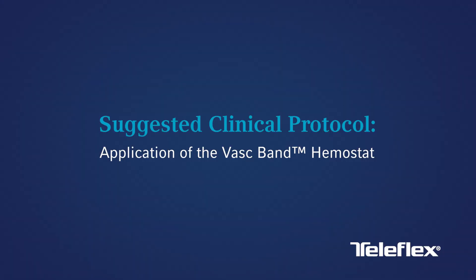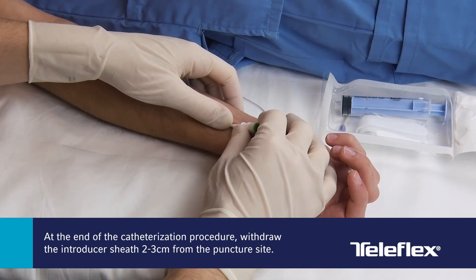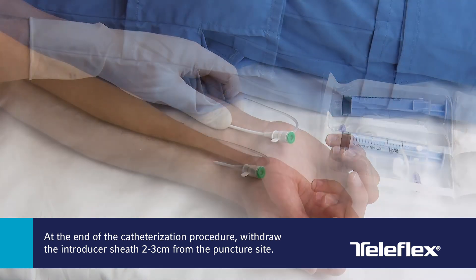Suggested Clinical Protocol — Application of the VASC-Band Hemostat: Using sterile technique, open the pouch and transfer the VASC-Band Hemostat and syringe into the sterile field. At the end of the catheterization procedure, withdraw the introducer sheath 2–3 cm from the puncture site.